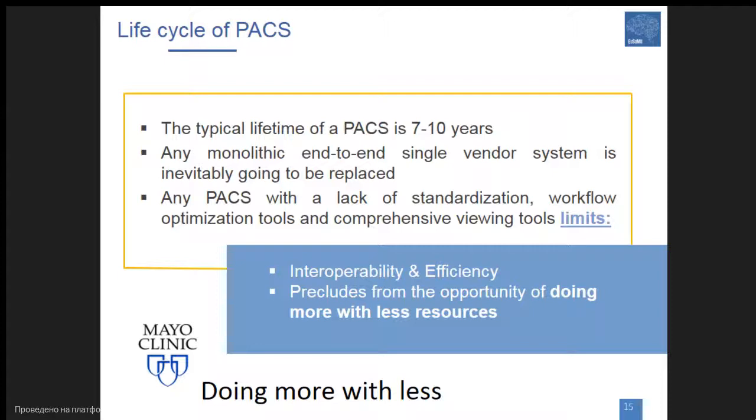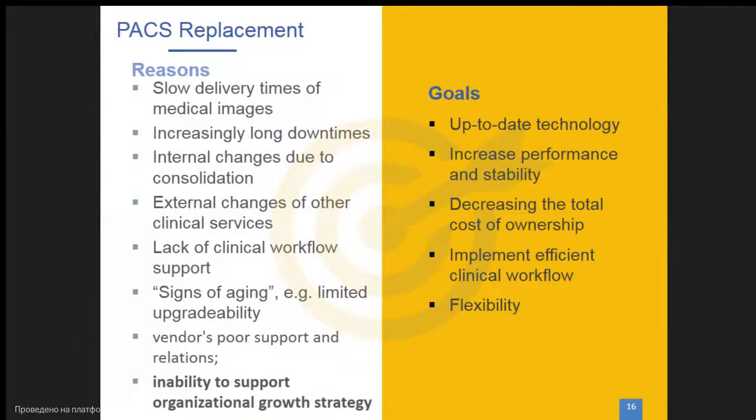Doing more with less is good. It does not preclude development. It doesn't mean that there is no money which will be spent on the system. It is something that Mayo Clinic uses for structuring its workflow and sending the message to the employees that we should do more with less. And every PACS system which provides standardized workflows allows this.